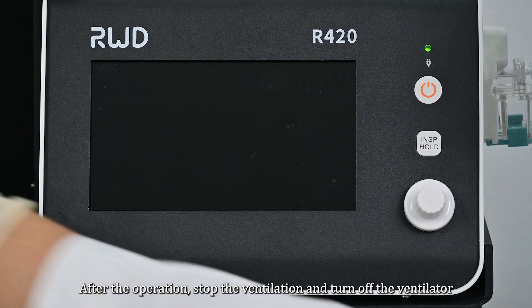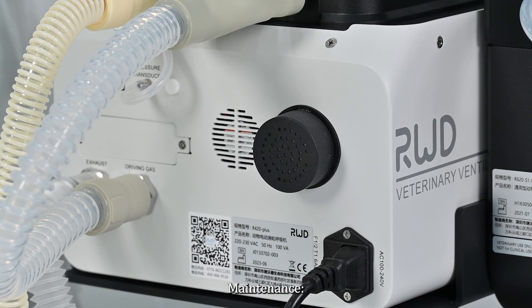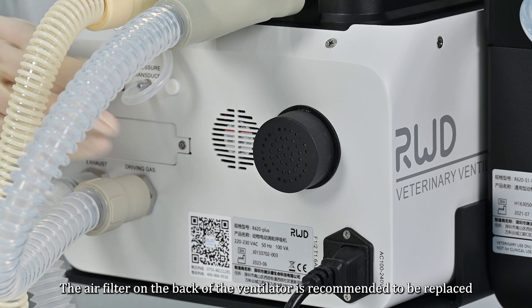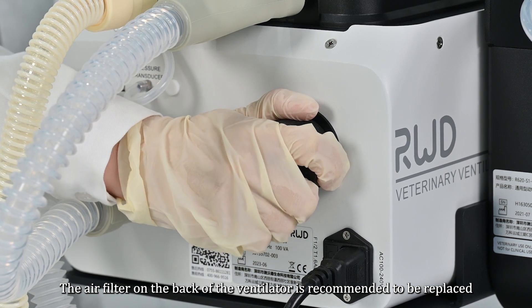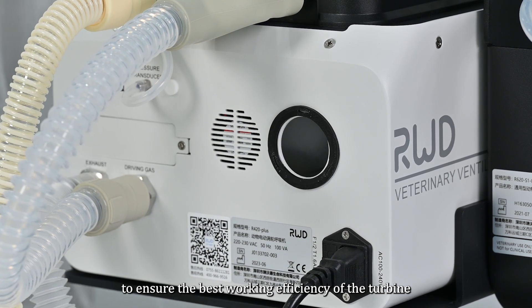After the operation, stop the ventilation and turn off the ventilator. For maintenance: the air filter on the back of the ventilator is recommended to be replaced every 3 to 6 months to ensure the best working efficiency of the turbine.